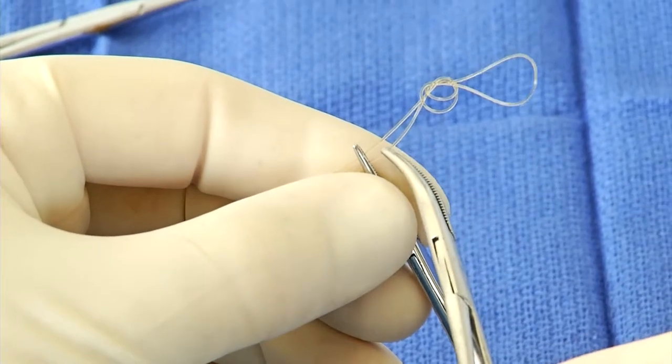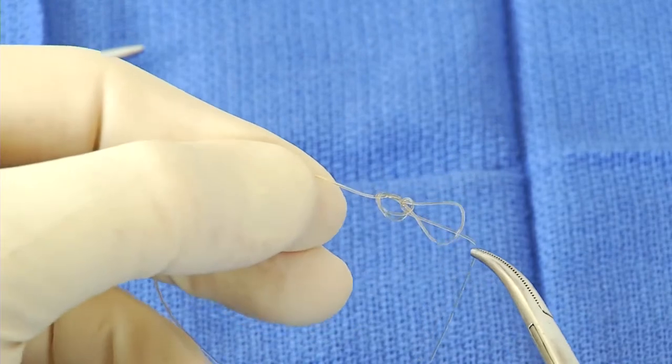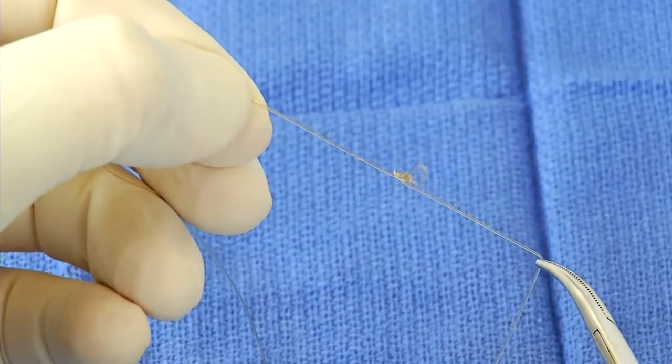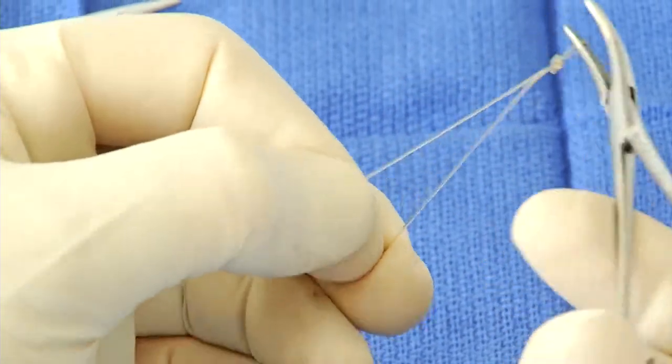Once you've got it to here, you have the opportunity to make it small — and you definitely want to have it small. You don't want to have the loop too large. Everything is so magnified once you put it in the abdomen.